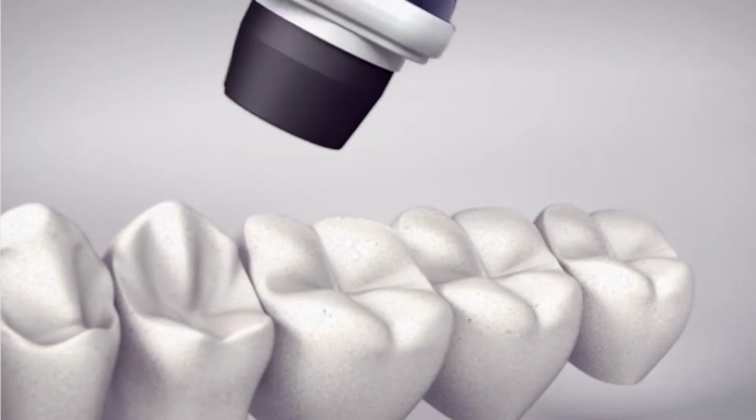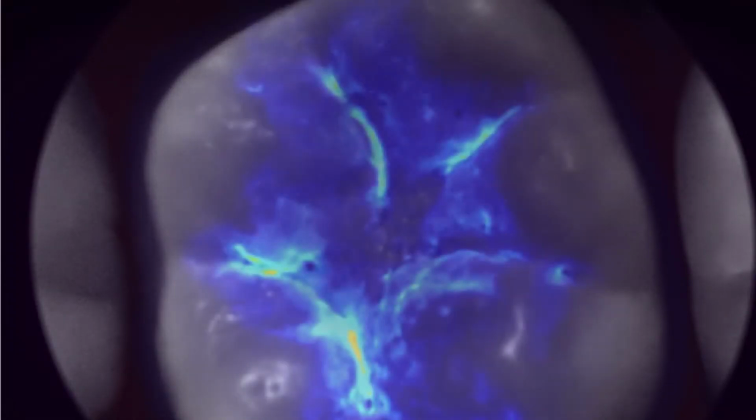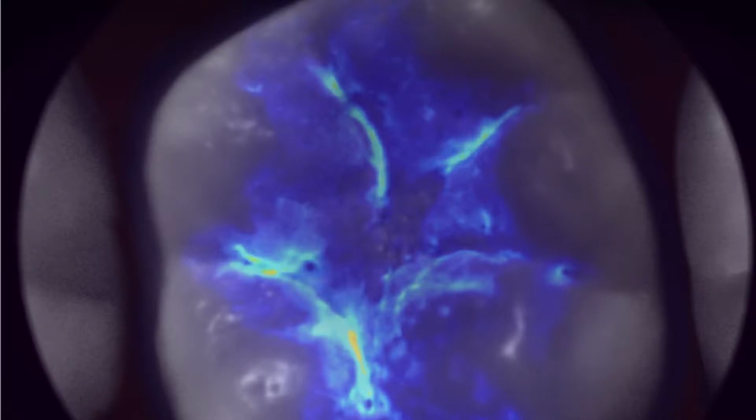It's important to note that this is not the classic fluorescence that we see for other detection devices. This is a pure chemical reaction between the calcium and the photoprotein, which produces this light. So there's no excitatory light. The other thing to note is that calcium that's bound in the crystalline structure, where it should normally be, doesn't give a signal. We only see a signal when the calcium has been released from that crystalline structure and is in its ionic form.